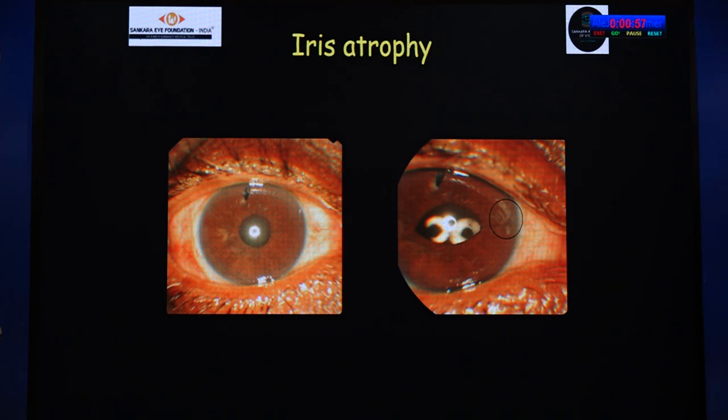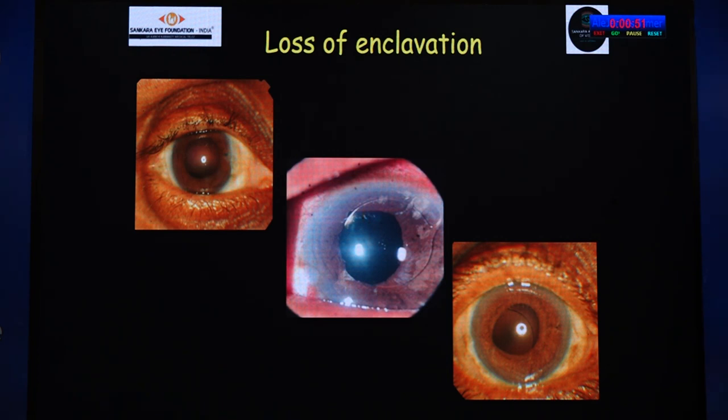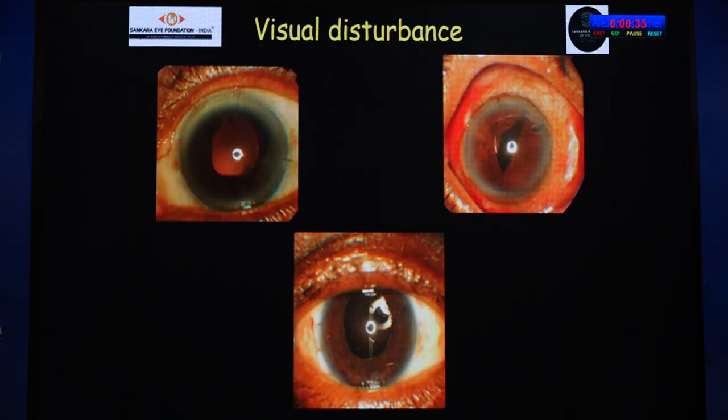At the site of enclavation, there can be iris atrophy, which can lead to loss of enclavation. If there is only one side that has lost the enclavation, the anterior segment surgeon themselves can just prolapse it into the AC, whichever side is lost, and it can be refixed. If it has totally dropped down, my retinal friends are definitely here to help me out. If things are not done in the right way, we can land up in situations like this. But again, no need to apprehend. These can be disenclaved and re-enclaved also. Disenclavation of the iris claw is definitely tricky, but not an impossible task.